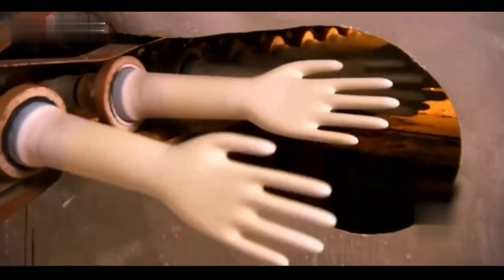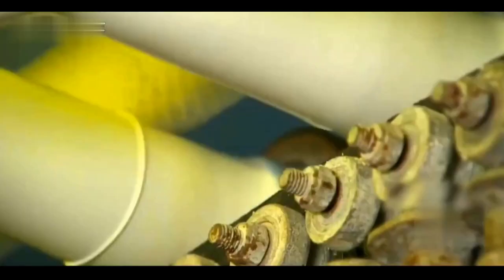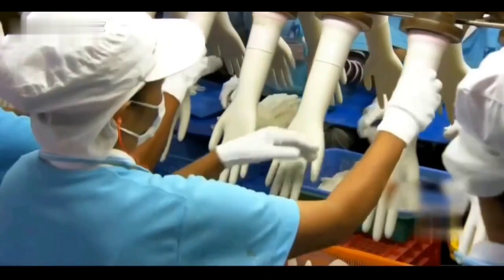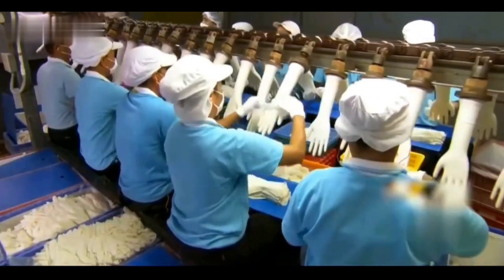After vulcanization and shaping, the rubber becomes both firm and elastic. Then the dried rubber is rolled while the cuff is turned up by the machine, making it easier for workers on the assembly line to remove the gloves from the molds.